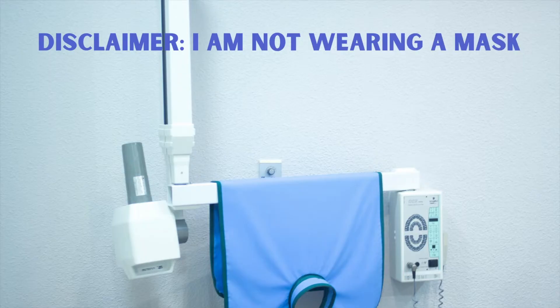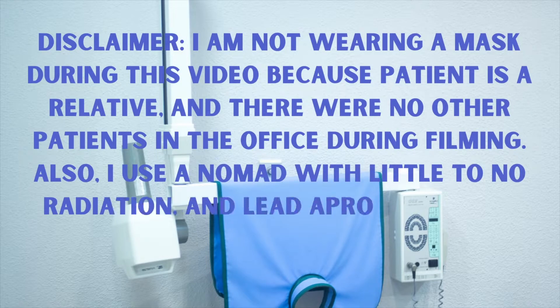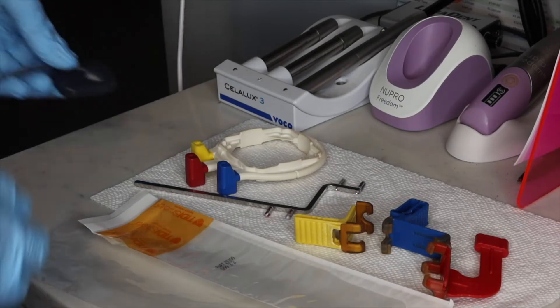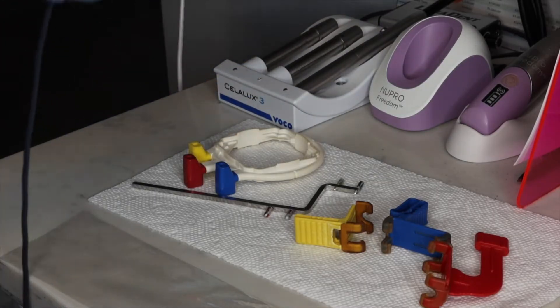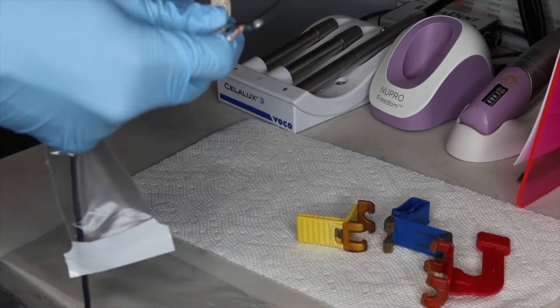I'm going to give you all some quick tips and actually show you me doing it on a patient, so I don't want to spend a lot of time rambling. First thing first: the obvious — go ahead and have everything out that you're going to need. That means the ring devices — posterior, anterior, and bite wing bite tabs — along with the sensor and a protective sleeve. My setup usually looks something like this: pretty simple, straight to the point.